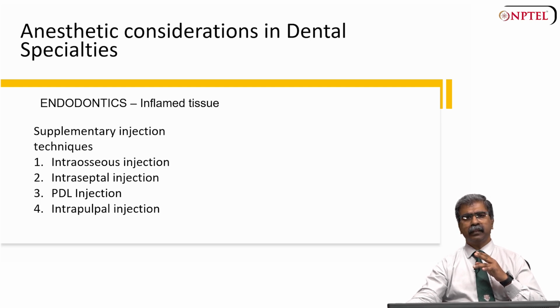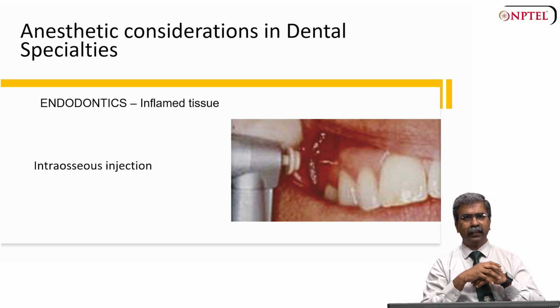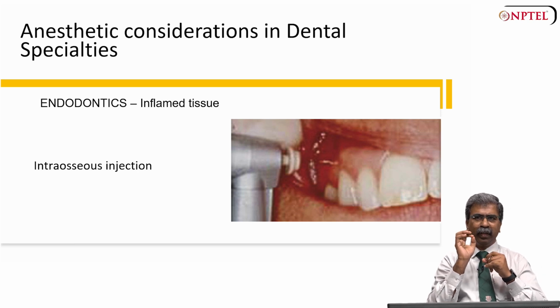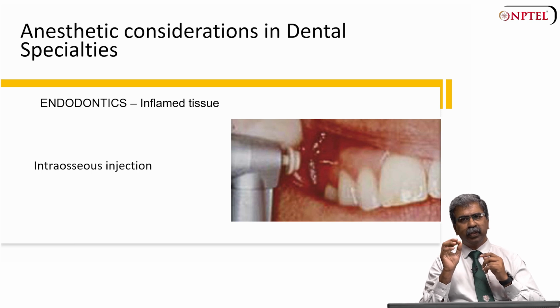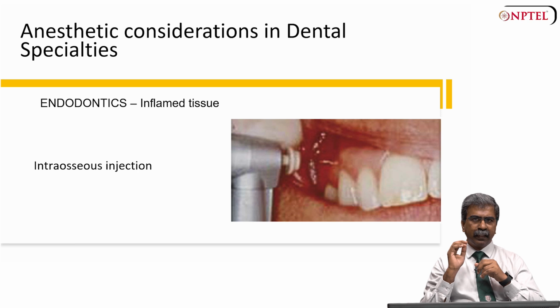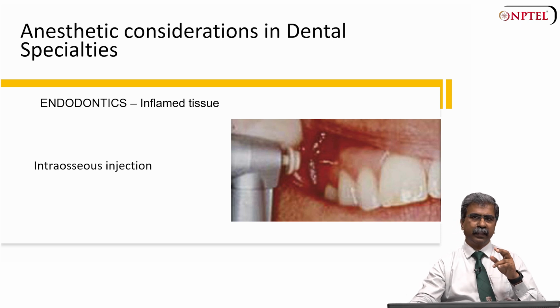This is an intraosseous injection. Apply topical anesthetic. Prepare a small perforator hole into the cortical plate. Push through the attached gingiva till the tip rests on the bone, and inject LA into the hole, into the bone, to achieve intraosseous anesthesia.